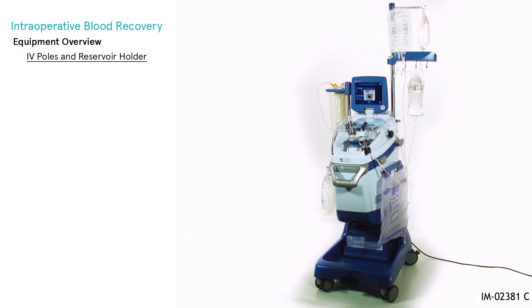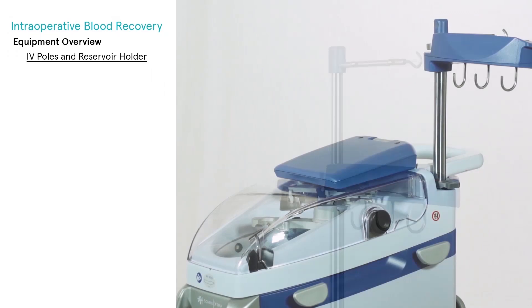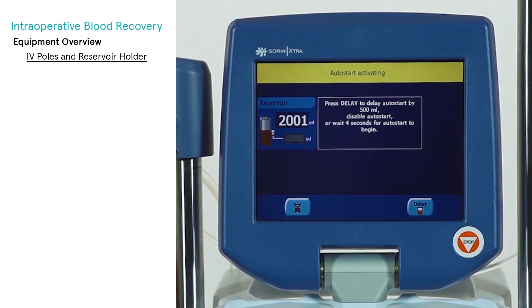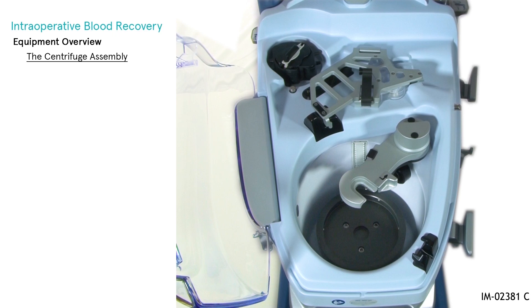IV poles are lifted by pulling up. They are lowered by lifting up the corresponding locking lever while pushing down on the pole. The reservoir holder contains a weight-sensitive sensor, which allows the system to detect the current volume of the reservoir. This allows the auto-start feature to start the processing cycle as soon as a pre-set volume of blood is collected inside the reservoir.